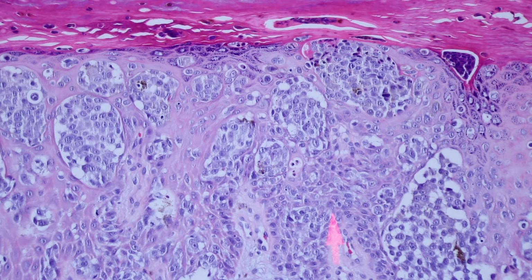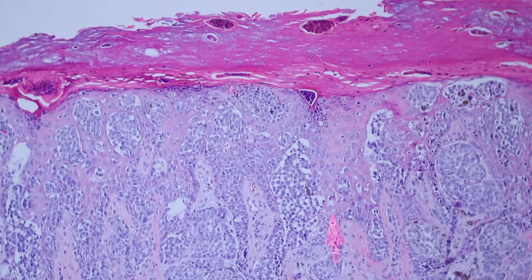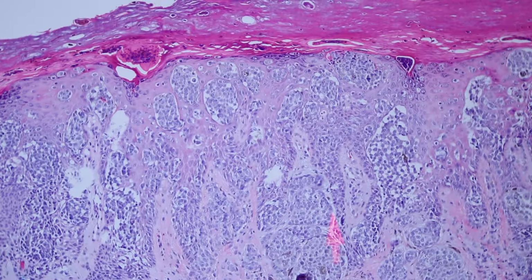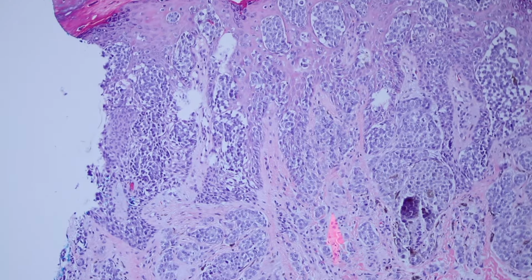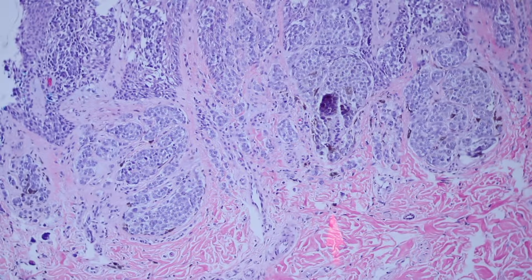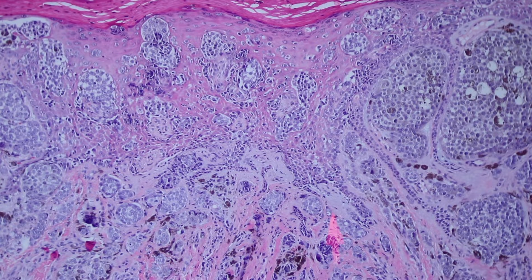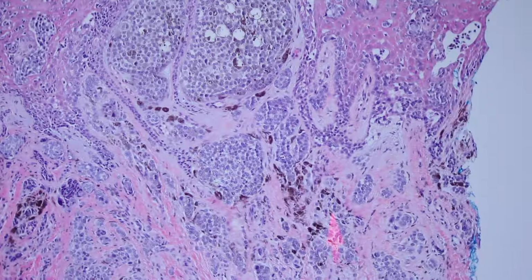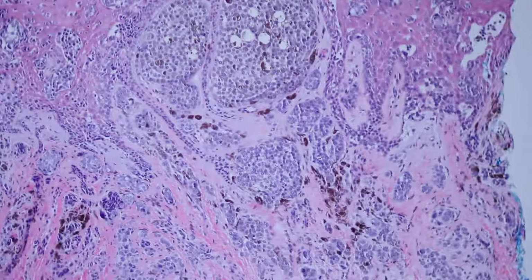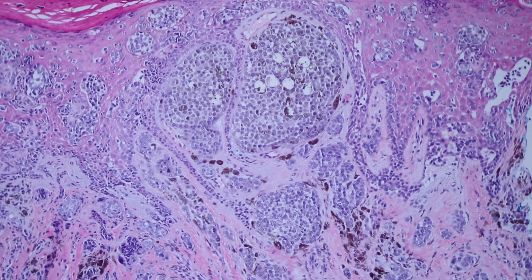Obviously, in a case like this, once you have some experience in dermpath, from the second you put this slide on the scope, you say this is going to be a melanoma. It's a pretty easy, really classic, dramatic example, okay? And here, another thing we can look at in this case and talk about is maturation. Maturation is somewhat of a complicated topic to talk about.